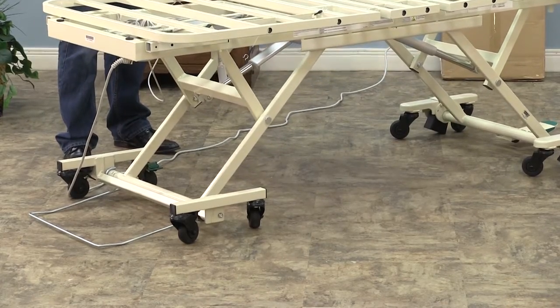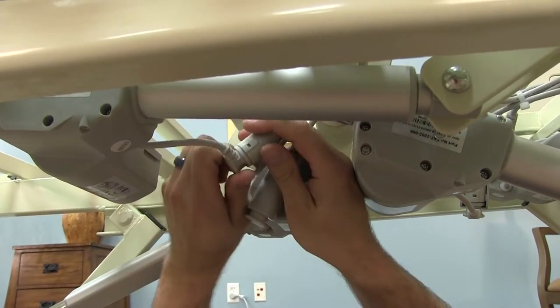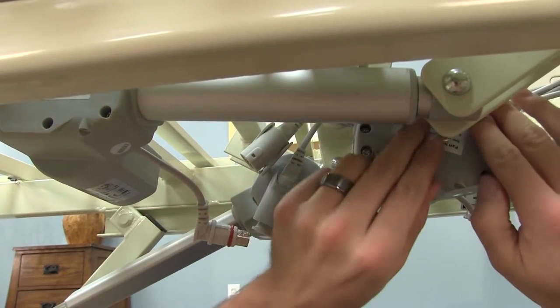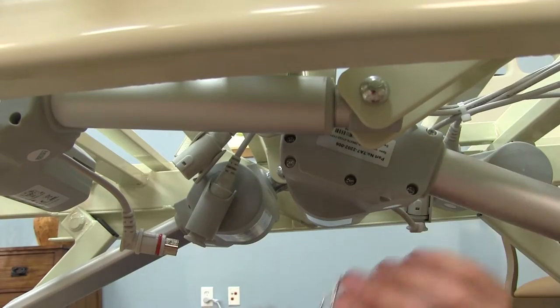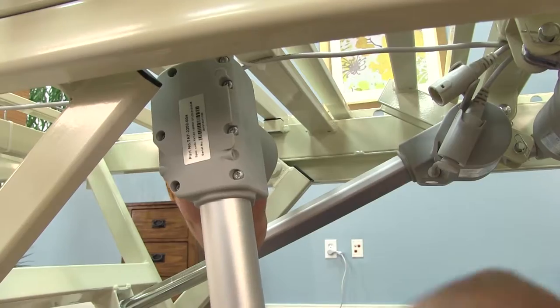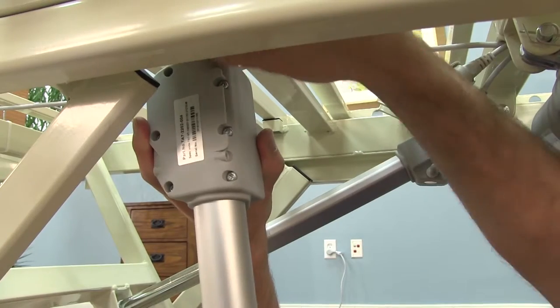To begin the replacement, start by disconnecting the control cable with the quick disconnect points located near the actuator. Remove both clevis pins, first by disconnecting the retaining clip and then sliding the clevis pin out completely.